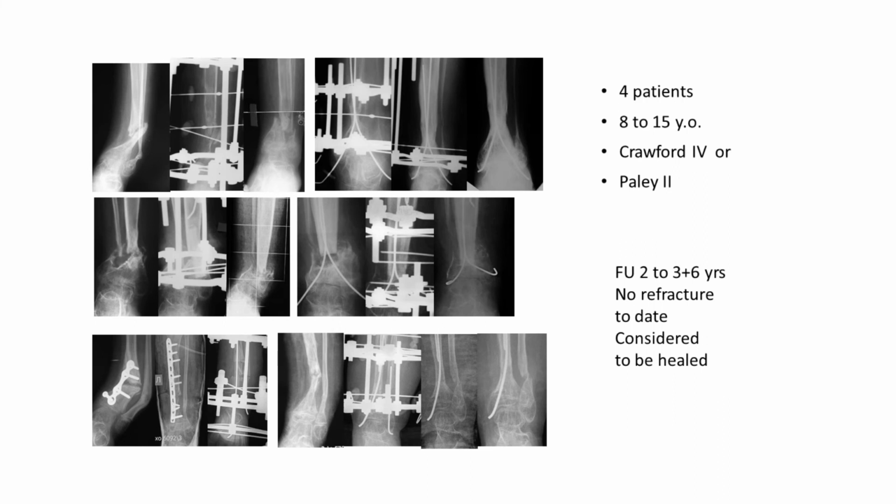We have a short series of patients with Crawford 4 CPT treated with a combined technique using hydroxyapatite coated nails. In management of CPT, we distinguish mechanical or surgical features and biological ones. Surgical ones are use of external fixator, ensuring realignment, decreasing risk of refracture, long-lasting intramedullary nailing or rodding, maintaining medullary canal open, stability of fibula, and increased cross-sectional diameter of bone obtained by appropriate pathological bone and fibrous hamartoma removal. The biological aspect is provided by osteoinductive coating of the intramedullary nail stimulating bone formation.